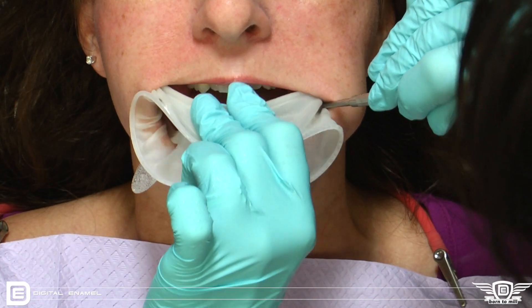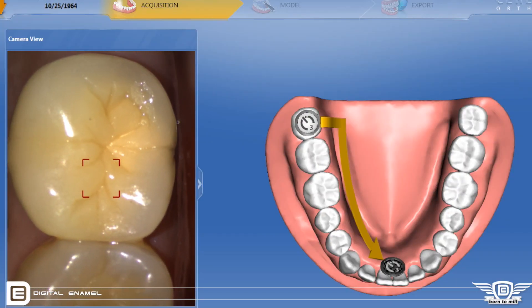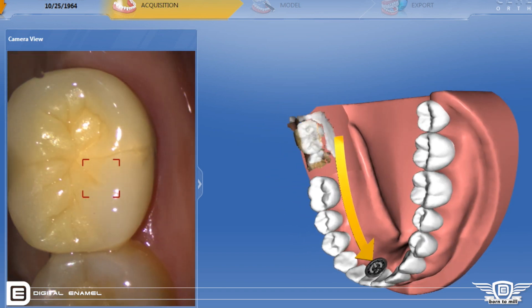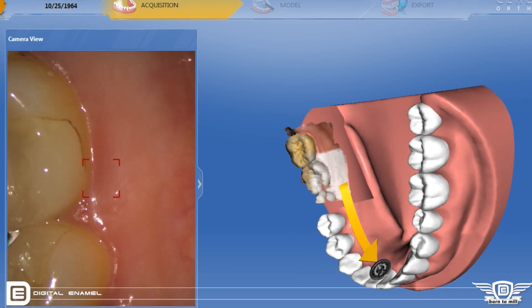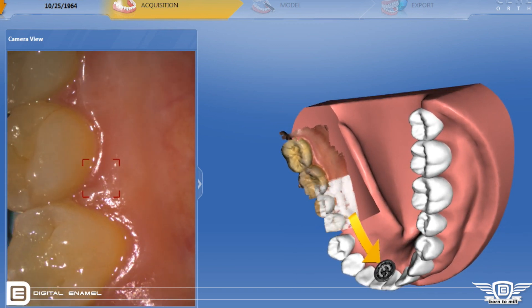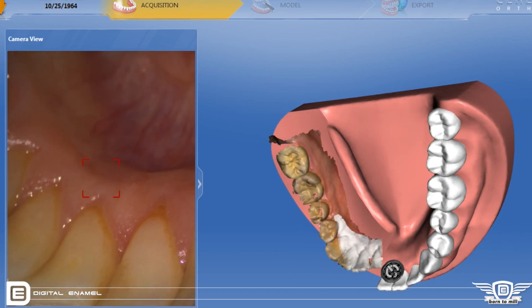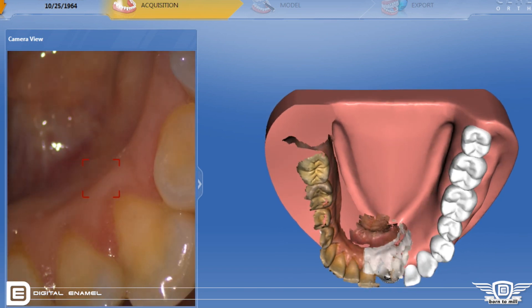It's really easy. You just put an Opturgate in the mouth from Ivoclar Vivident. You just start scanning where the camera tells you to — put it right over the most distal molar. It registers on its own and then you build the model in sections. You'll see here that I'm imaging the lingual and then it comes across towards the midline to a stopping point, and then it automatically stops.